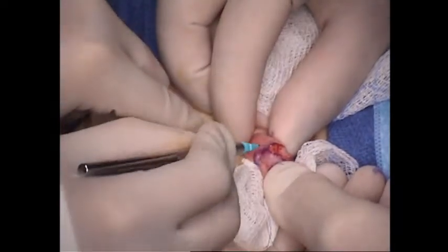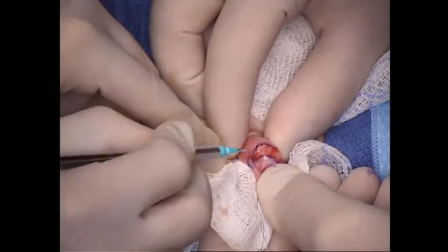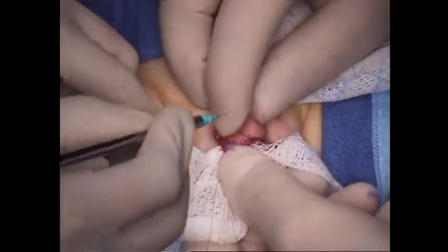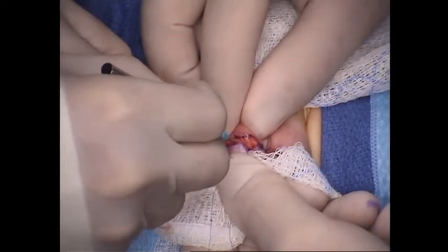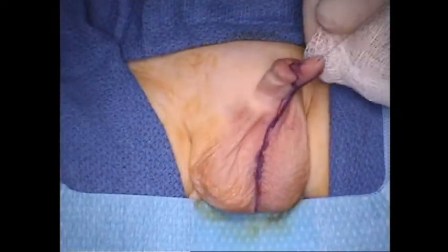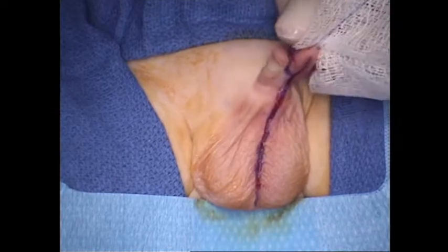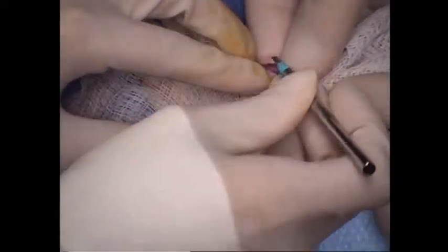So there's just no reason to use oral mucosa, especially in a child whose family wants them circumcised, because you have all of this beautiful foreskin to use instead. And one of our goals in making this film is to show exactly how to do the operation to be certain that there's enough foreskin not only to make the male urethra, but just as importantly, to be able to cover the penile shaft in a normal fashion.